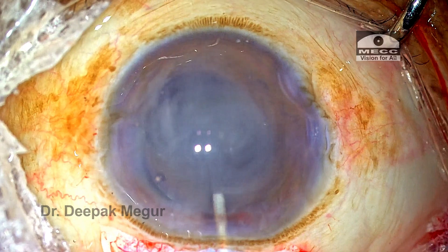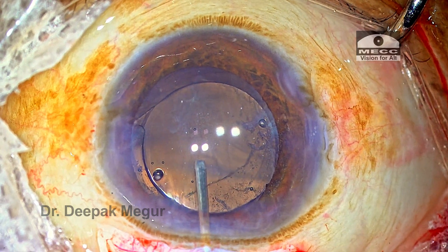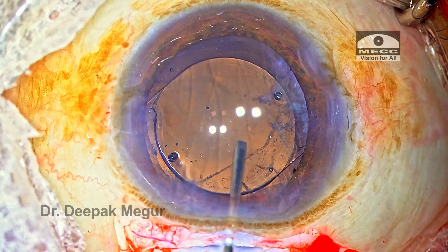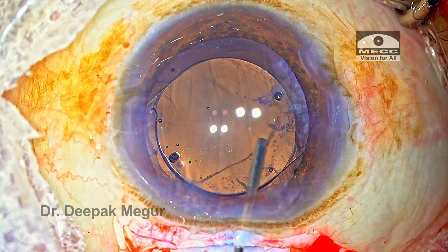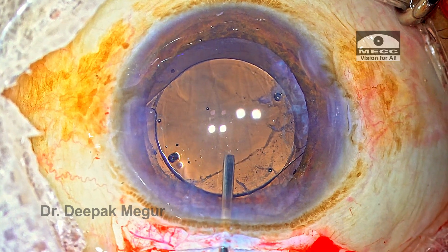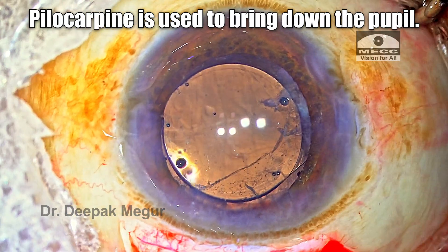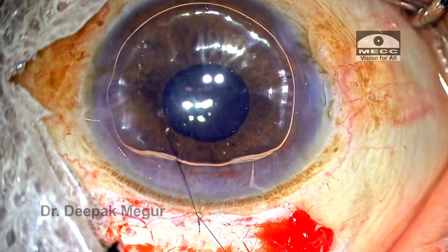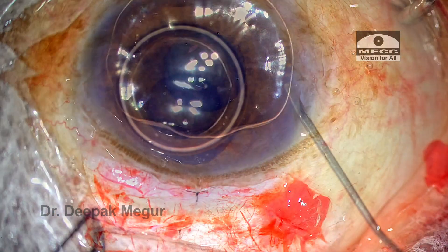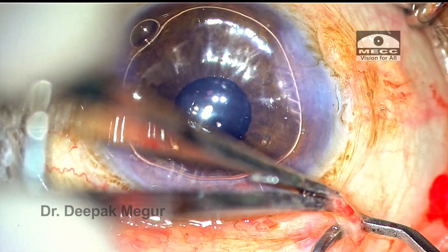She retracts the iris with the Y-hook to confirm the lens is in place. Triamcinolone acetonide is injected to confirm there is no prolapsed vitreous — there is none. Carefully, the OVD in front of the lens is irrigated out, and the lens looks stable. Diluted pilocarpine is used to bring down the pupil. The main incision is sutured under an air bubble, the side ports are hydrated, intracameral antibiotics are placed, and the case is done.